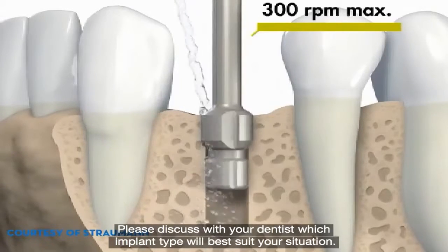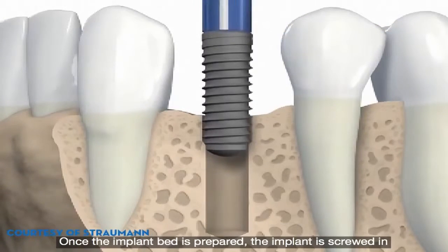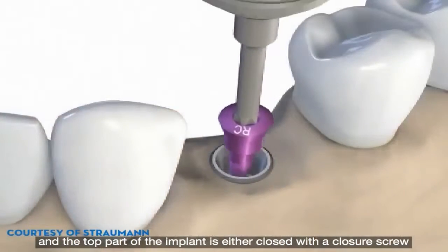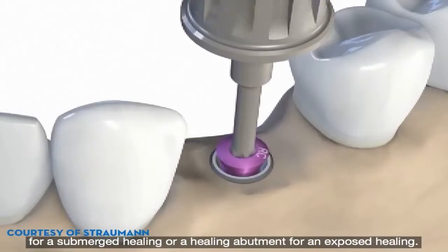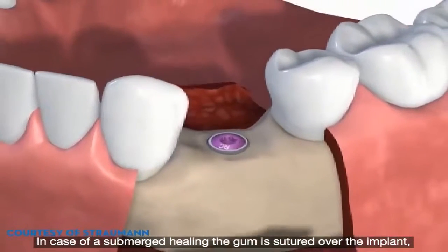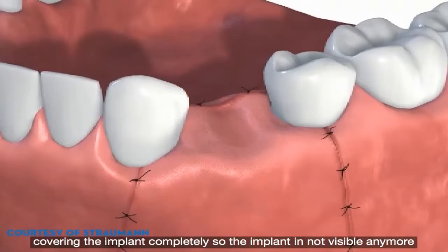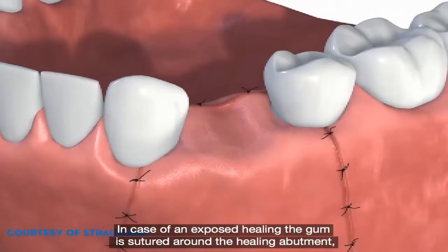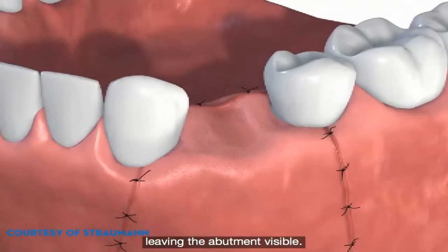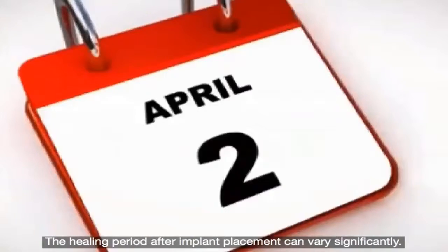Please discuss with your dentist which implant type will best suit your situation. Once the implant bed is prepared, the implant is screwed in and the top part is either closed with a closure screw for submerged healing or a healing abutment for exposed healing. In submerged healing, the gum is sutured over the implant, covering it completely. In exposed healing, the gum is sutured around the healing abutment, leaving the abutment visible.